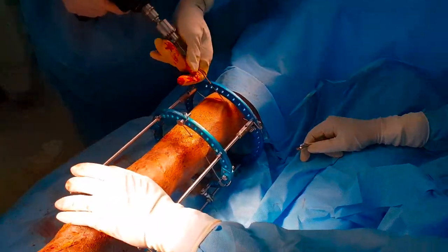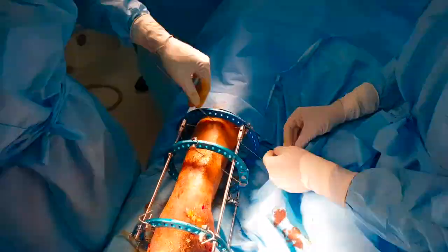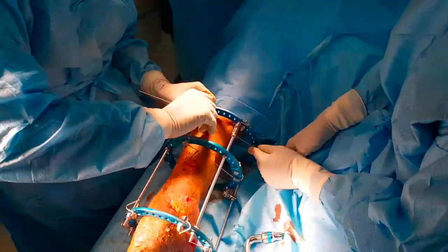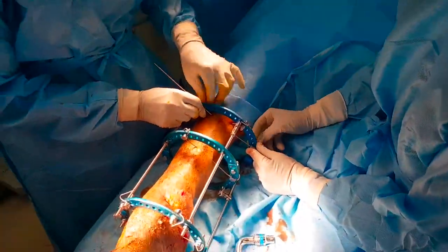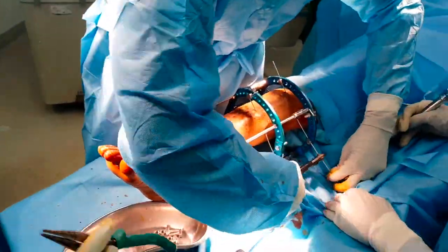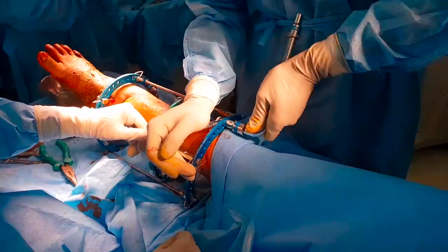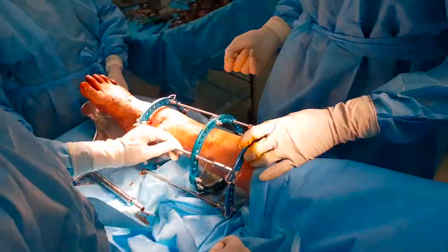The perpendicular wire for the most proximal ring is passed, and once again it is attached at one end and tensioned at the other. One must ensure that one wire passes on the top side of the ring while the other wire passes on the bottom side of the ring.